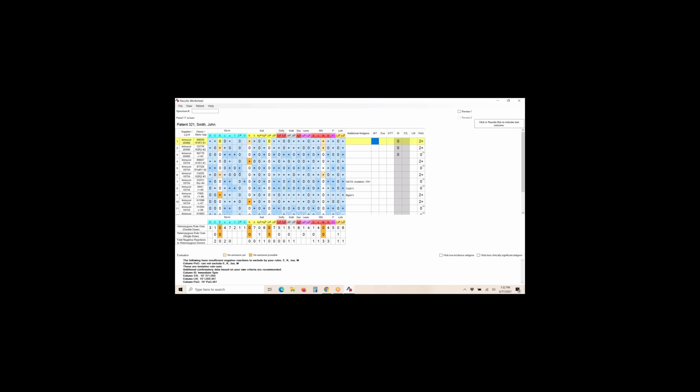You're also going to see dark orange now in the array. You have 1 here for the E, and that's it, that's dark orange. And for K, you have 2 for K. And what that means is this reaction over here, there's nothing else on this row that's positive that could be causing a reaction.